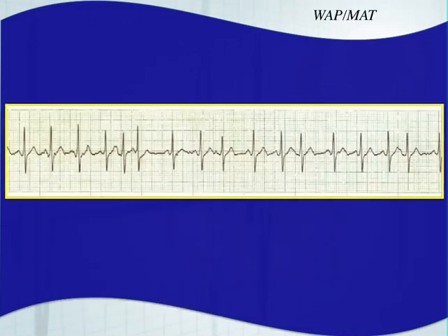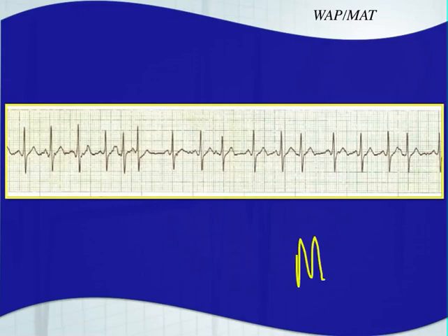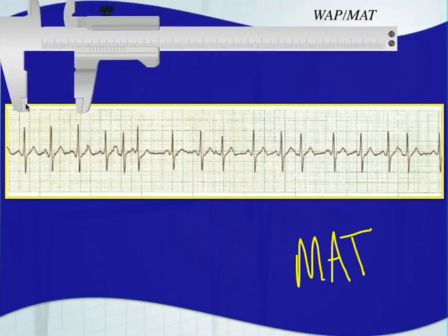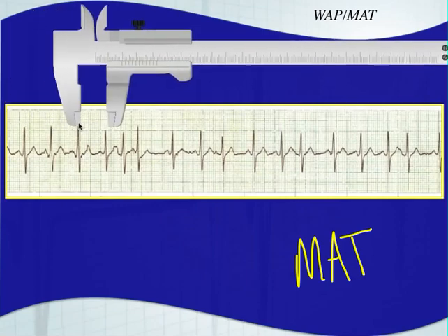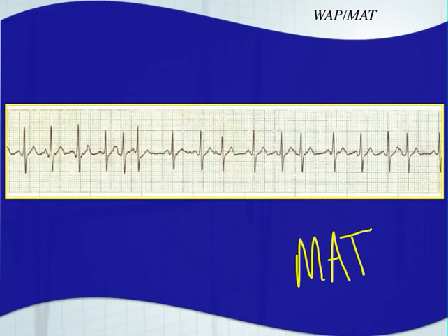Here's an example of multifocal atrial tachycardia because this one is obviously faster than 100 beats per minute. You'll notice the P waves are rapidly changing — you have at least three different P wave morphologies and no extra P waves. Your PR intervals are changing on this EKG and your QRS complexes are narrow. This would be considered a multifocal atrial tachycardia. It is very irregular — if we measure that out, it's very irregular. Your P waves are all different shapes and your PR interval is constantly changing.